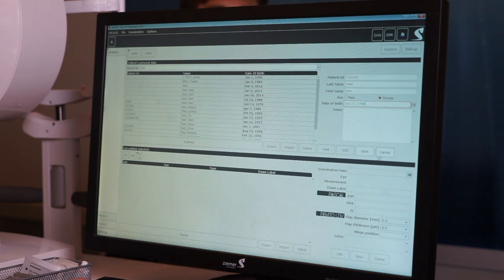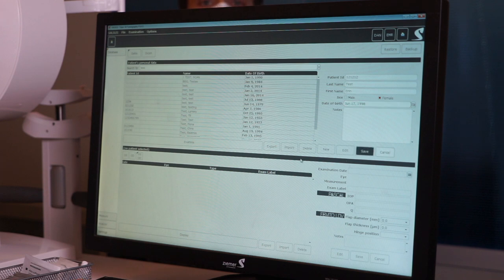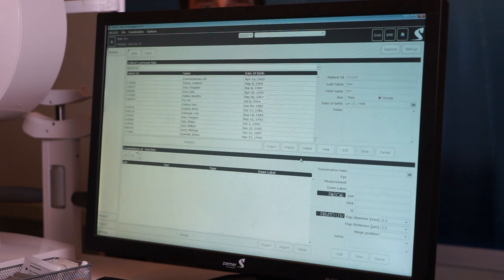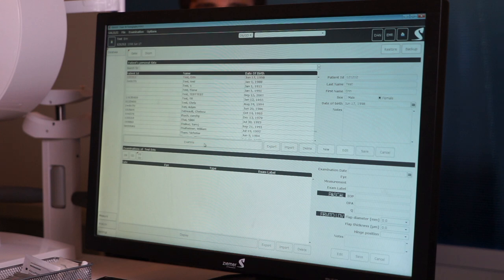Have them confirm their full name and date of birth before continuing. Then hit Save, and hit Examine.